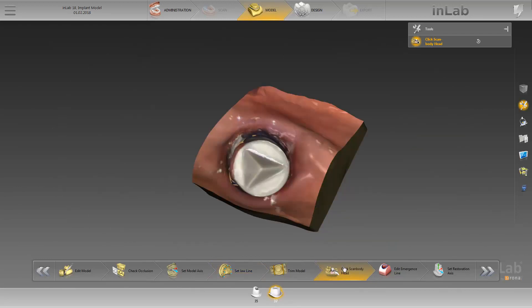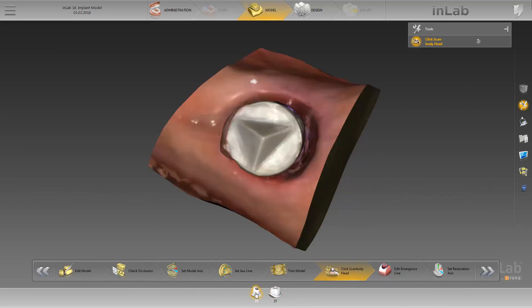If the purple dot is placed on the tip of the pyramid, the implant position has already been calculated. Otherwise, you can double-click on the tip of the pyramid to start the calculation. You can jump between the individual implant positions via the restoration selector. The purple dot in the center of the scan body indicates now that the position has been defined.